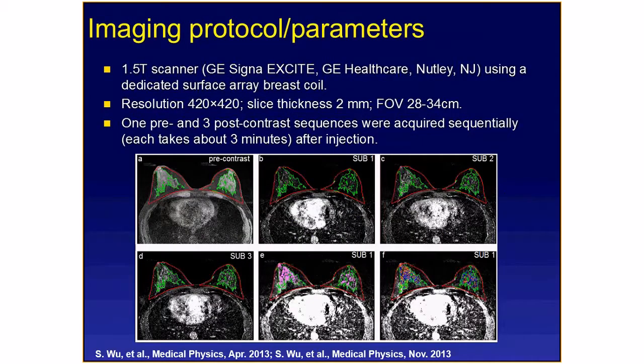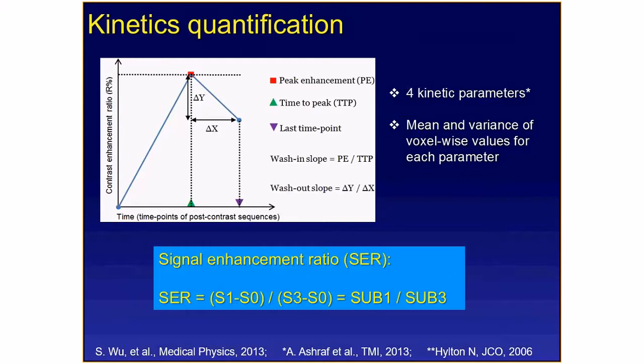So we compute, those are the imaging protocols. I will just skip that. For those images, we use the method to find the breast regions and dense tissues, and then the BPE and the kinetic features here. Those are different kinetic features. And also, you can see these are different views, these are actual views of breast images. These have to do with the different medical centers' protocols.